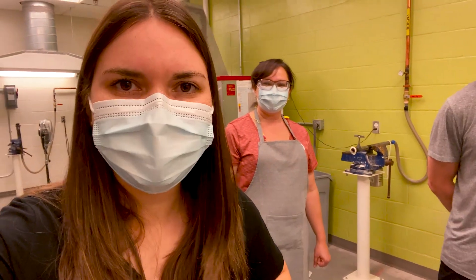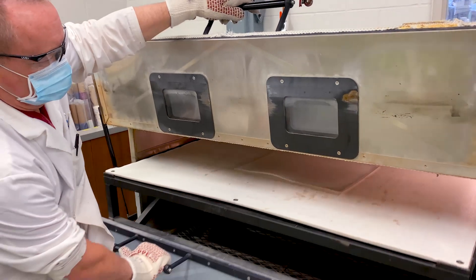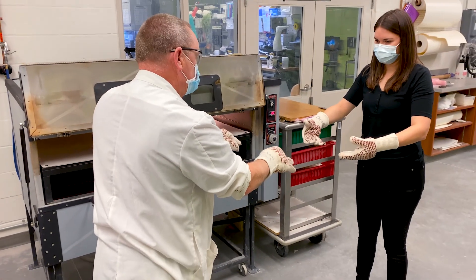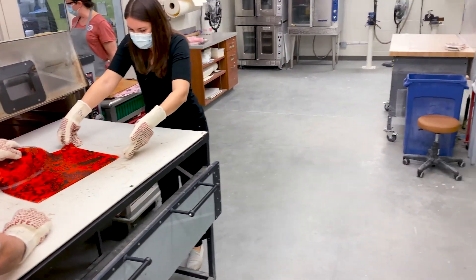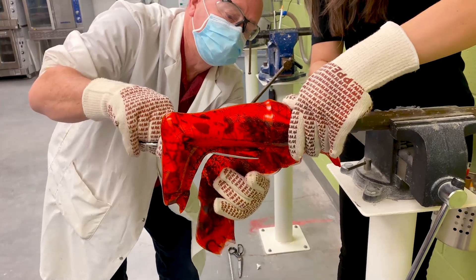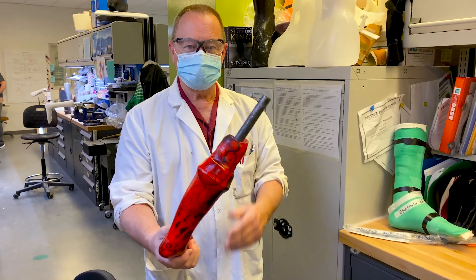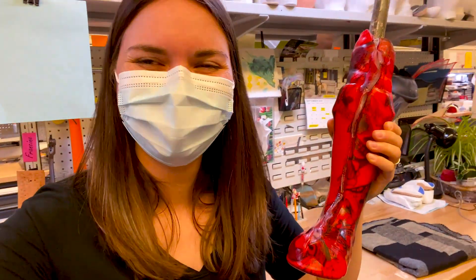So this is like the concept in medicine — you see one, do one, teach one. I've seen two, so now I'm going to do one. And there you go — here's your HKAFO you've molded. Oh my gosh, this is so cool!